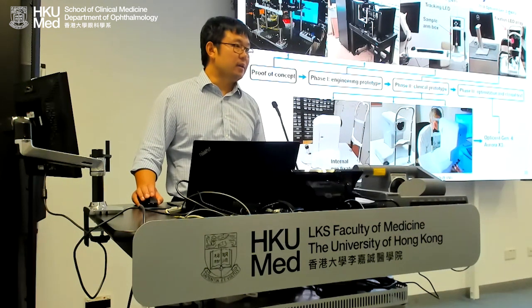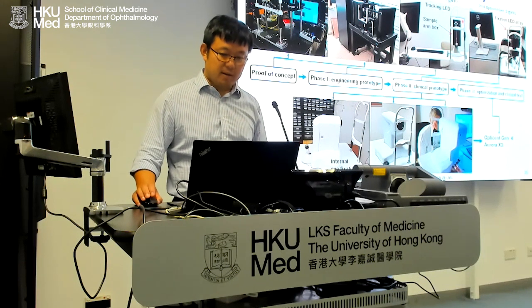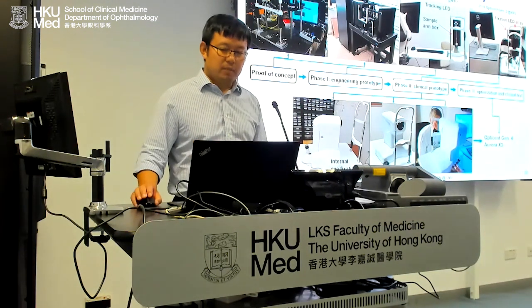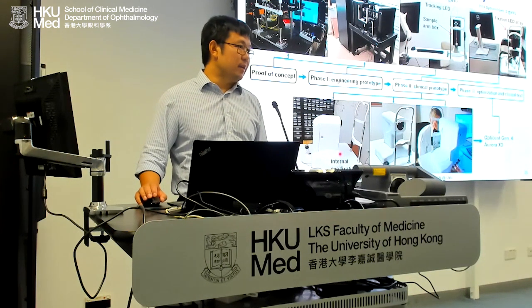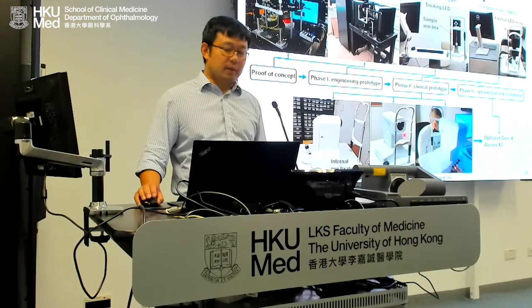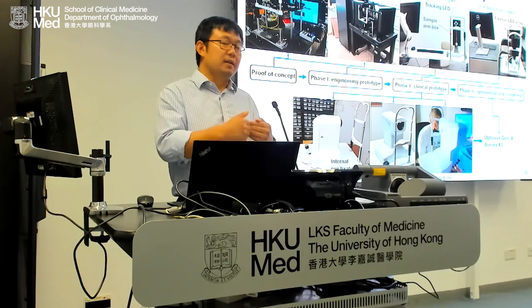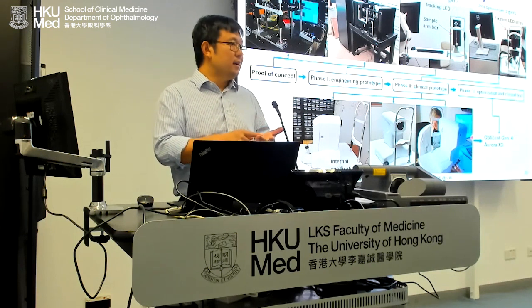2018, the second generation. Now from here to here sounds like a small change. From here to here, it's a huge change. Look at the big thing, it's packaged into a small box. The footprint remains comparable, but the eye fixation, the optical design, and the software become a lot better. During COVID, that was the third generation, and we made lots of mistakes. Any mistake possible, we made. In 2021, that was the latest generation. At least the footprint and the appearance are all the same. So we fixed that. And right now it is more software, usability, user feedback, this type of work.